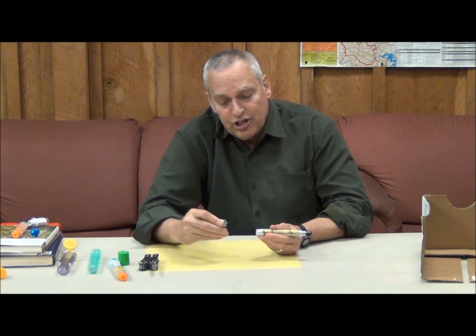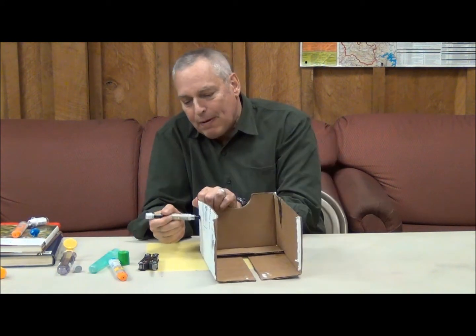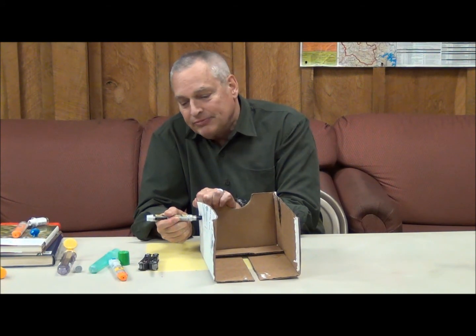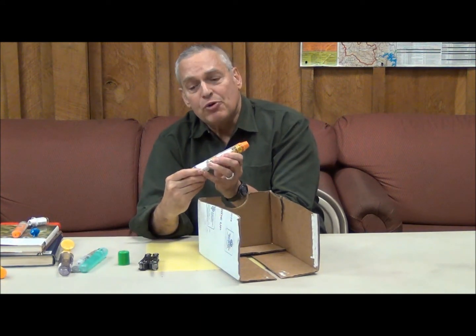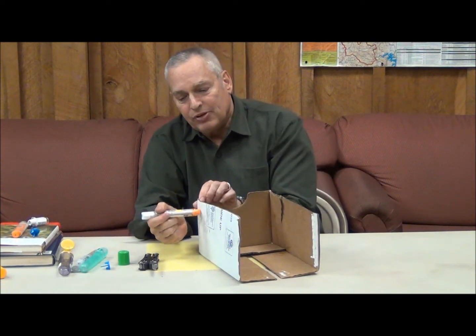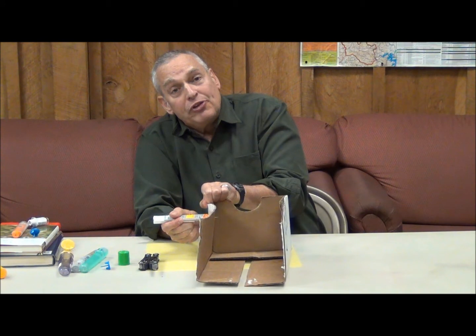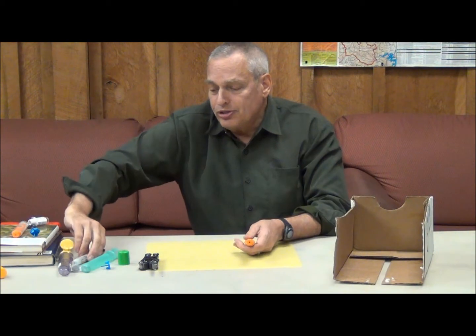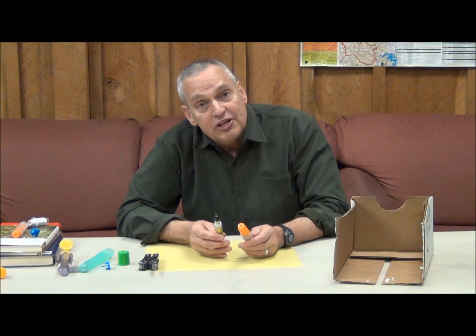We remove the safety clip from the old-style pen, and then we jab the thigh. Let's see here. And you can see how quickly the epinephrine is injected. Though I missed my finger. The new-style pen works essentially the same way by removing the safety, and within 2 or 3 seconds, the epinephrine is injected. You'll also notice that in the old style EpiPen, the needle remains exposed. In the new style pen, the needle is enclosed, making it easier to do.